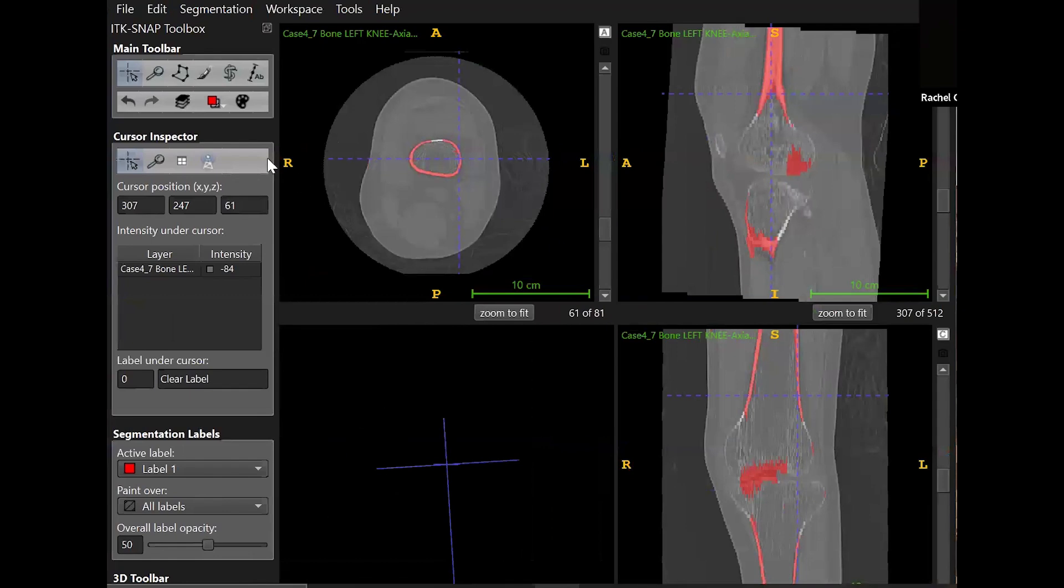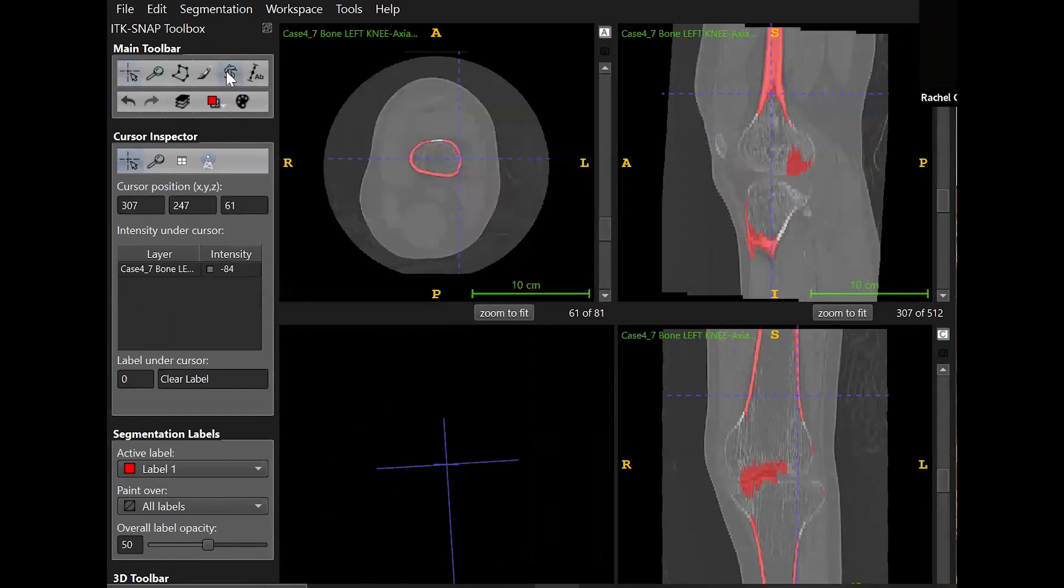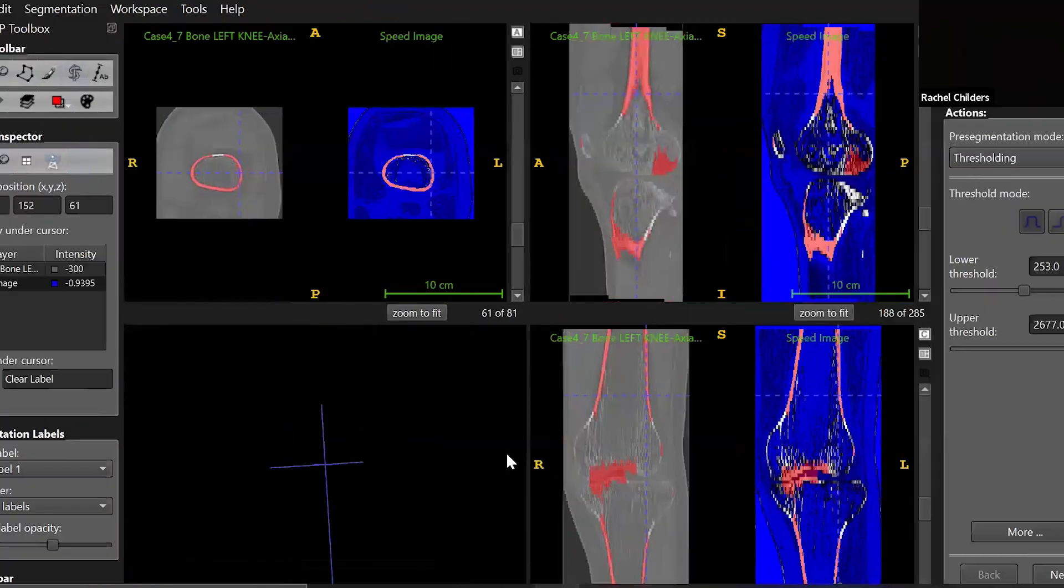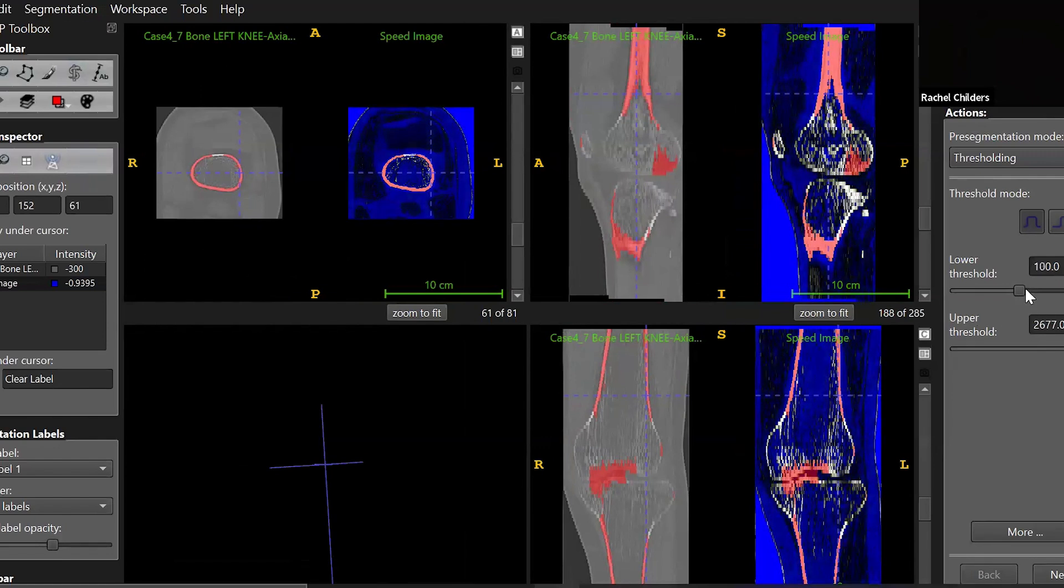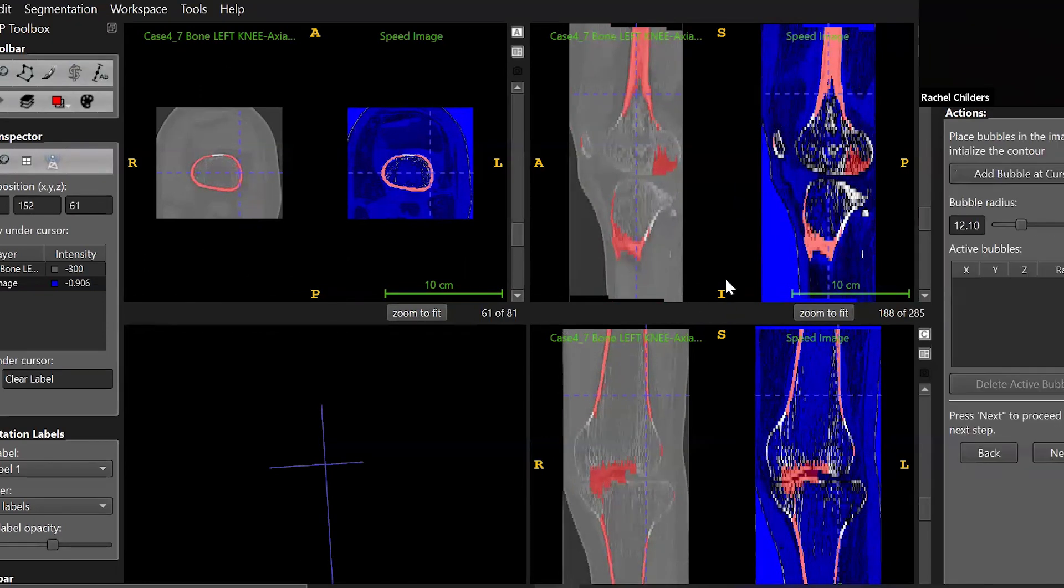Then start the segmentation process again using the snake tool. This time, select the box that says initialize with the current segmentation. You can go back and add more bubbles in the areas that the snake segmentation didn't reach the last time.